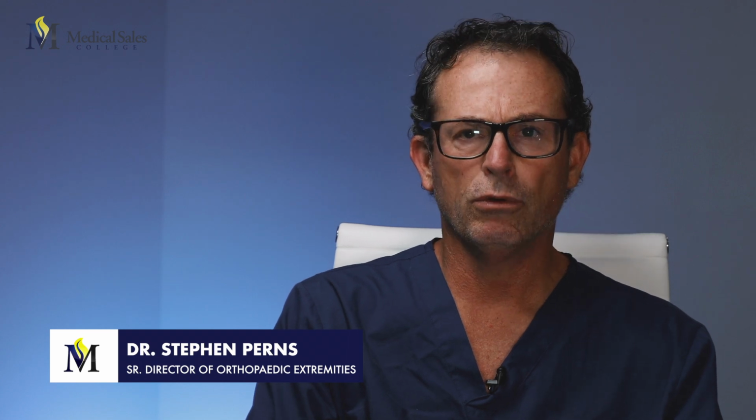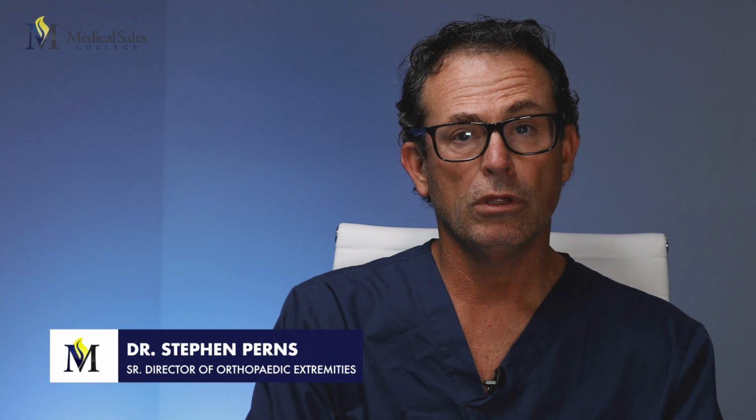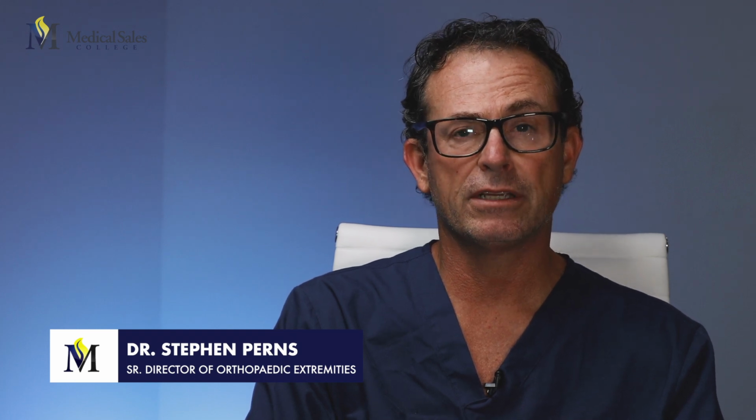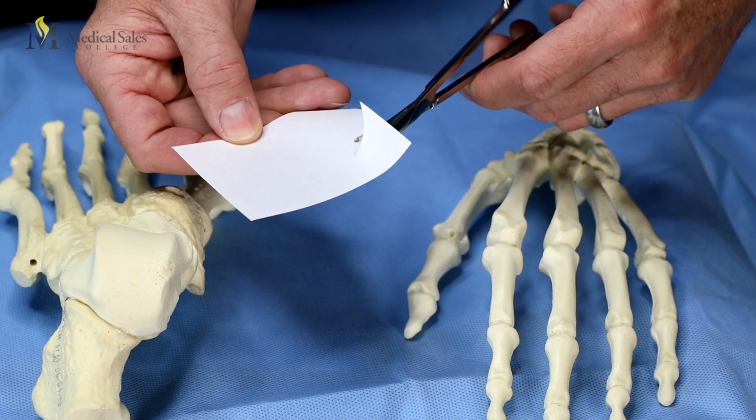This short video will go over different instrument categories. We have videos that will further take you through in more depth the various instruments that are commonly used in the operating room. The categories that we will be discussing are scissors. Surgical scissors are obviously used for cutting.